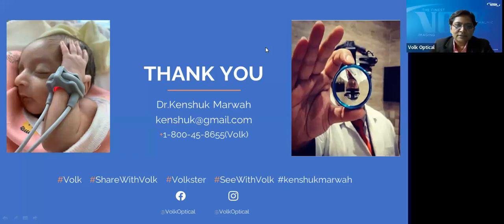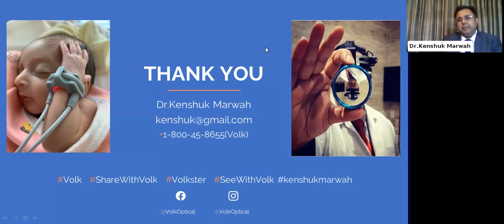Yeah, thanks for that, doctor. The next question is, what is the magnification power on the slit lamp while using the slit lamp? So I prefer, like I told, that the magnification should be bare minimum, because as you go on to a higher magnification, there's a lot of glare and the image moves. So don't jump onto a higher magnification first. Keep a lower magnification, lower illumination, and maneuver your hands, your wrist while you are doing it.